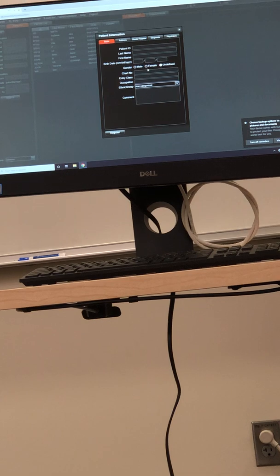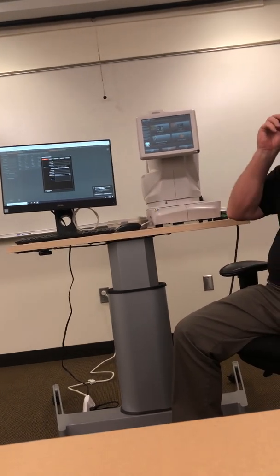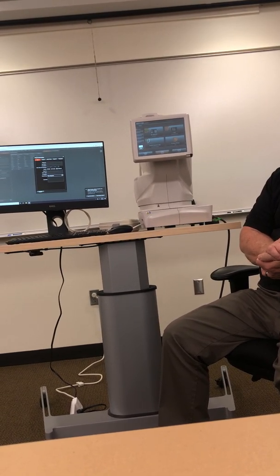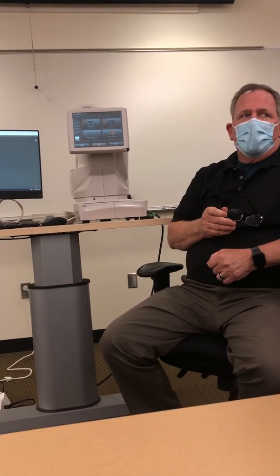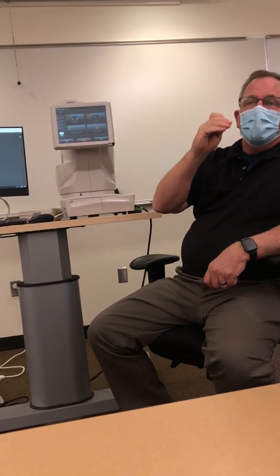Can I chime in for a sec? For our birthday, to protect our privacy as much as we possibly can, but not get away from the age-related normal or abnormal, we're just going to put in January 1st and then your year of birth. Because this is cool, because we can do that. We really don't want to know what everybody's birthday is. What we've been doing is just putting your first name and the first letter of your last name.